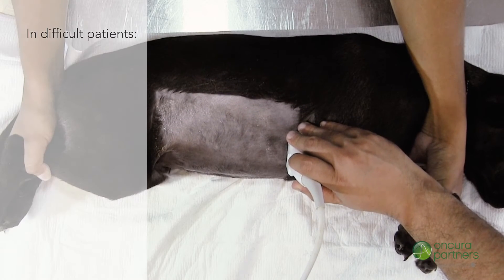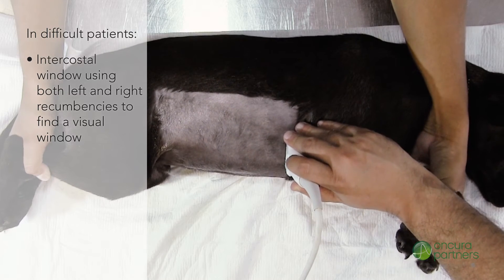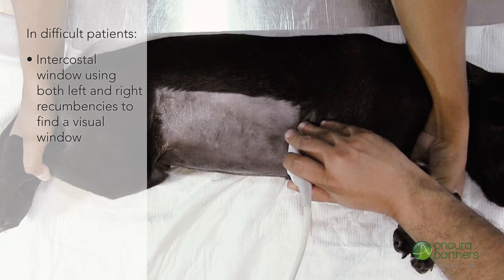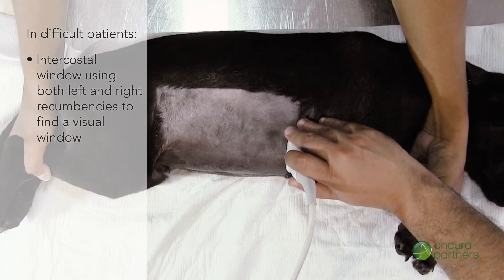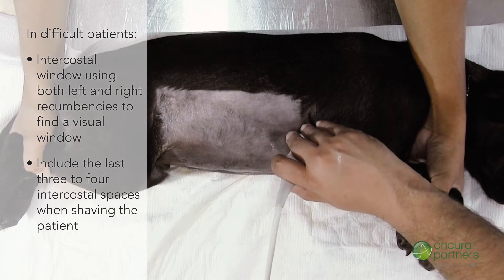In difficult patients, an intercostal window approach may be used, utilizing both left and right lateral recumbencies to find a suitable window. The last three to four intercostal spaces should be included when shaving the patient.